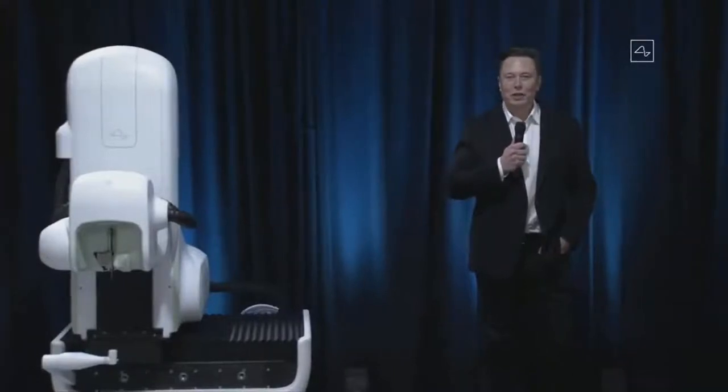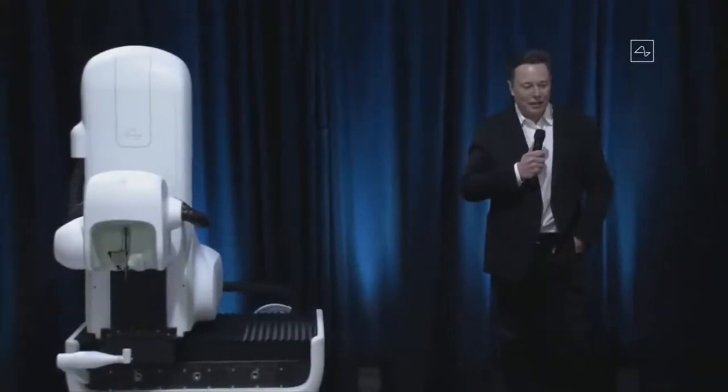Welcome to the Neuralink product demo. I'm really excited to show you what we've got. I think it's going to blow your mind.